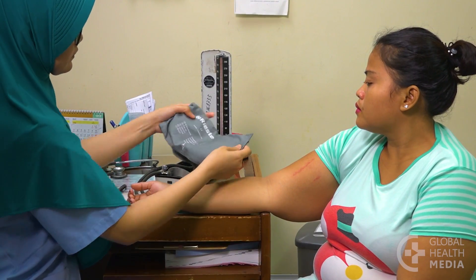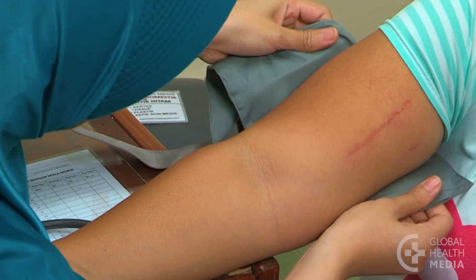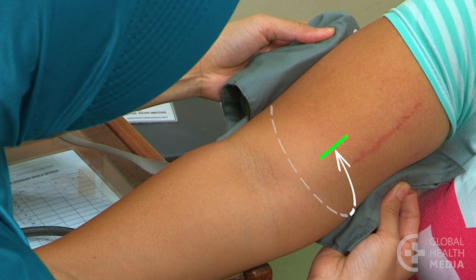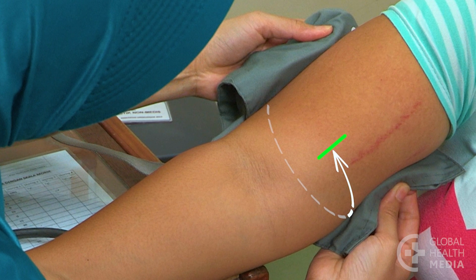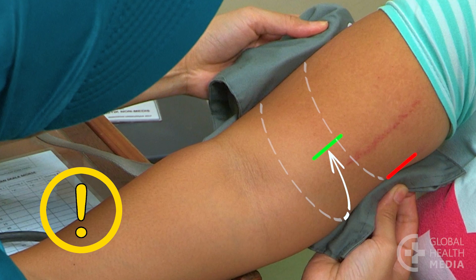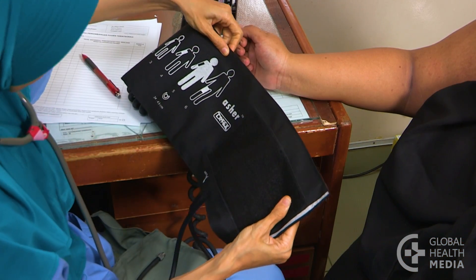The blood pressure cuff must be the right size. The bladder inside the cuff should go around at least three quarters of the upper arm. If the cuff is too small, use a larger one.